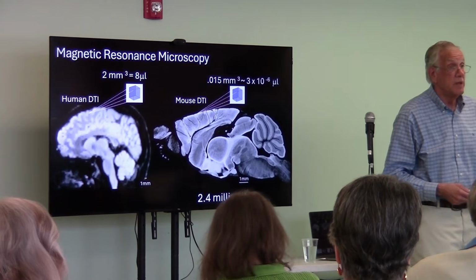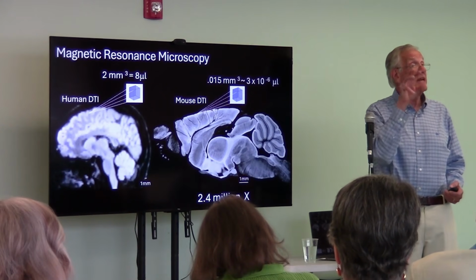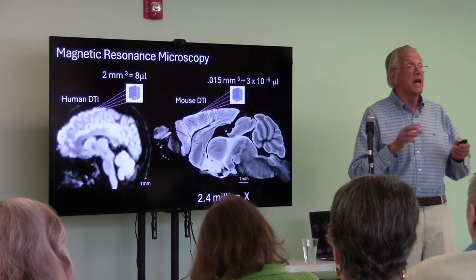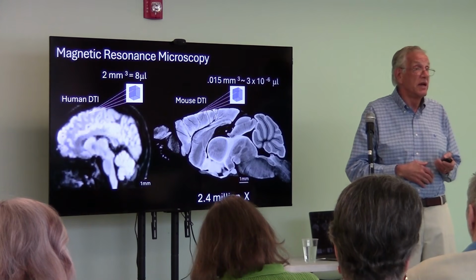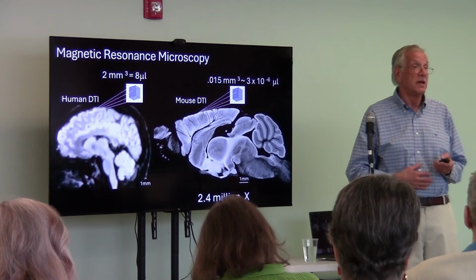No, it's a whole brain. And it's a whole brain in the skull. That's a big deal. We take the brain in the skull and scan the whole brain. So it's perfectly like the live animal in the sense that the geometry is as good as you're going to get. But the animal's dead. The animal is dead. Okay.